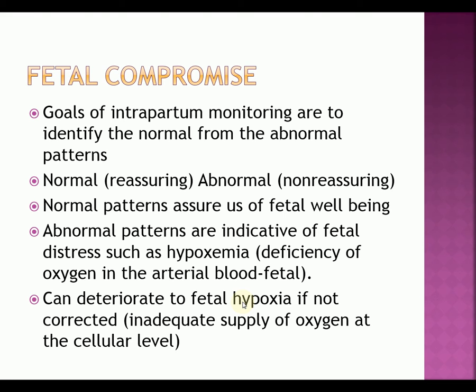Now you may see me or hear me say reassuring pattern every once in a while because I grew up with you either had a pattern that made you feel reassured or you didn't. But basically, it's normal or it's abnormal. Normal patterns assure us of fetal well-being. It tells us that our fetus is well oxygenated. Our fetus has a normal oxygen base in there. We have good acid-base balance. So normal patterns tell us that our fetus is doing really well.